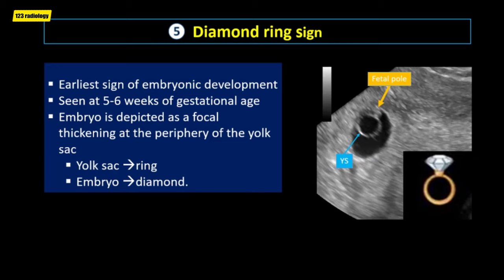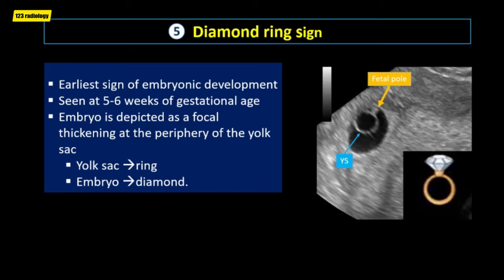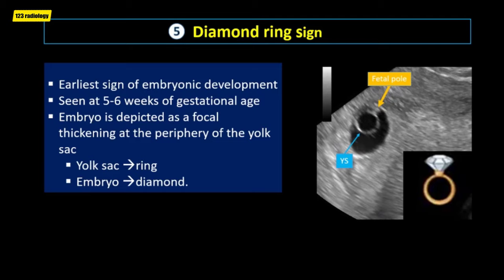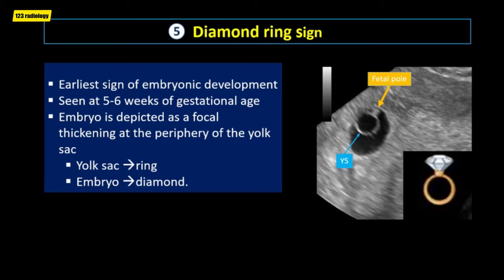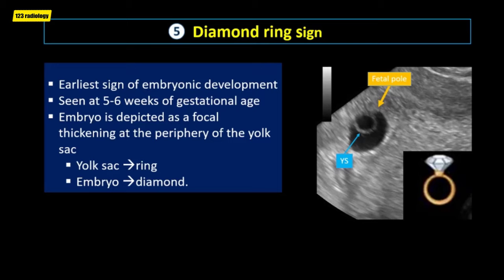The diamond ring sign is the earliest sign of embryonic development. It is seen at 5 to 6 weeks of gestational age by transvaginal ultrasound. The embryo is depicted as a focal thickening at the periphery of the yolk sac. This appearance is referred to as the diamond ring sign, where the yolk sac represents the ring and the embryo represents the diamond.